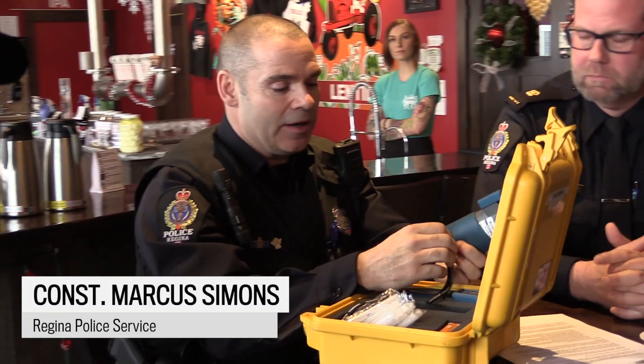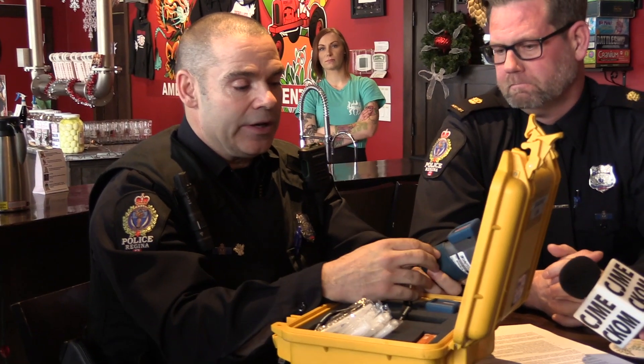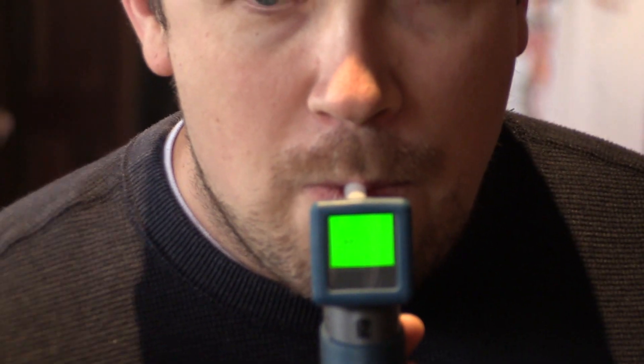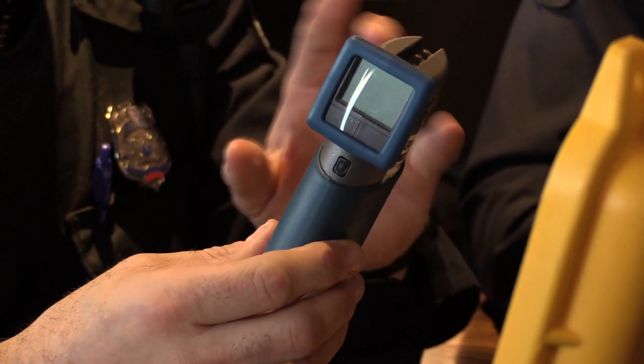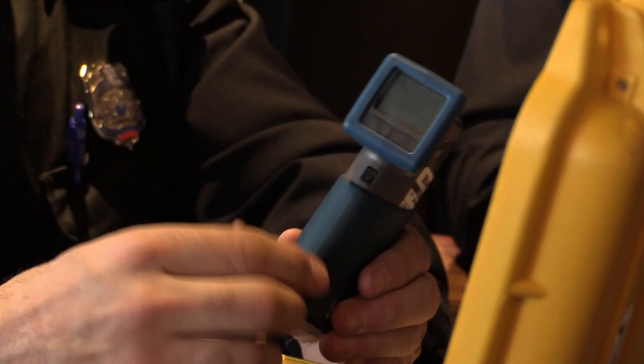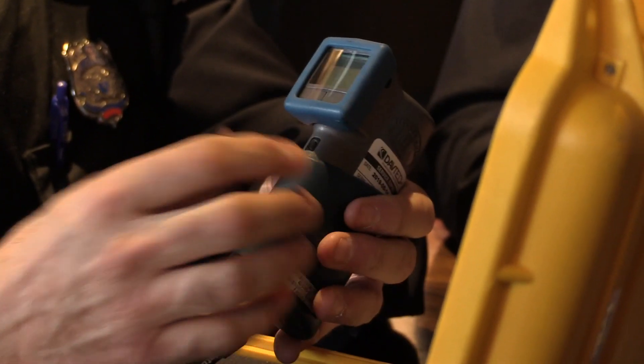I refer to it as almost like a traffic light: green, amber, red. Green is calibrated from zero to 49 milligrams of alcohol. If anything over that, it'll just go red and that means a fail — it'll say the word fail. So then we move into the impaired investigation at that point.